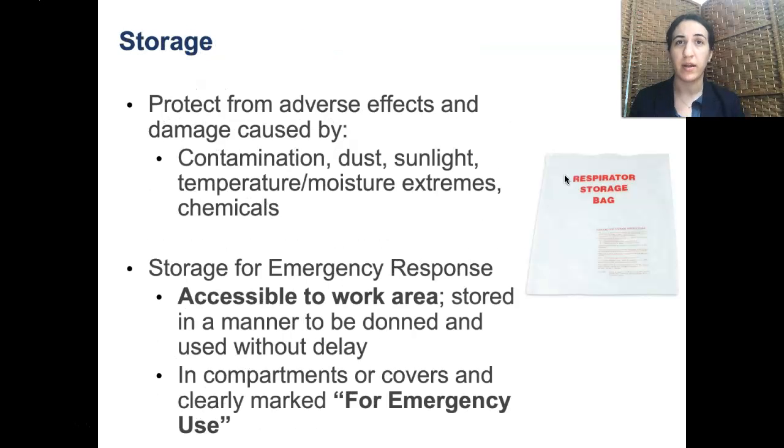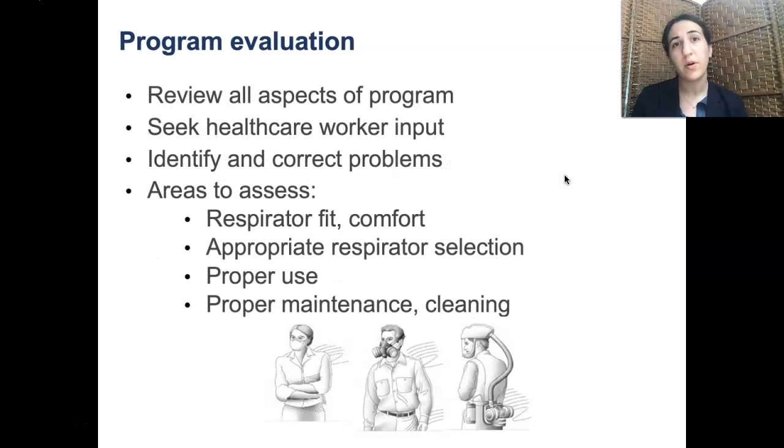Another important component of respiratory protection programs is storage. It's important to protect the respirators from damage caused by contamination, dust, sunlight, chemicals, and temperature extremes. Consider where you would want your respirators in an emergency and have them be accessible in the work area. Lastly, it is important to evaluate your program. Input from healthcare workers is extremely valuable here. Some areas to assess include the respirators themselves, as well as how they are being used, cleaned, and maintained.